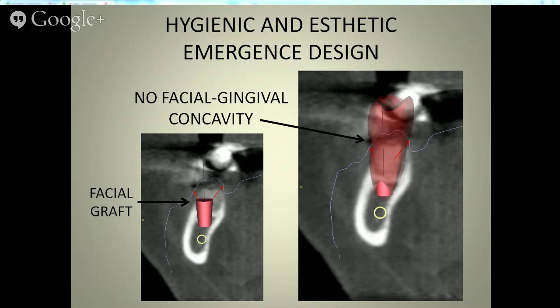If you want to, we have a CT order form, we call it, and on that form, it's really a prescription that we use for these kinds of cases, and we have a section in there that says, would you like a radiological reading of this scan? And we can do that. It's not incorporated into the software. We send the plan to the company we use. They look at it and they send back a radiology report, and they'll tell us if the nerve's in the right place.